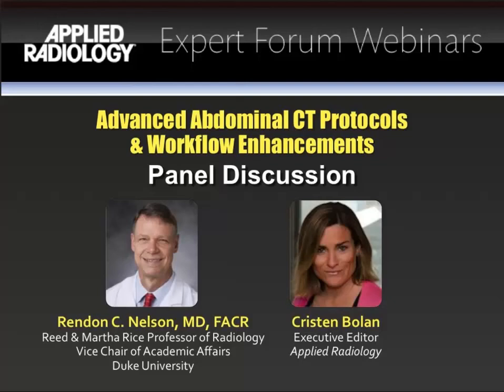And can you comment on how you pick and choose saline chaser volume and rate, and how that changes image quality, contrast distribution, scan time, etc.? So basically, as I mentioned, we use a 50 ml volume, and we did experiments in phantoms where we did 25, 50, 75, and 100, and basically the effect peaked out at 50, and that's why we chose that number.